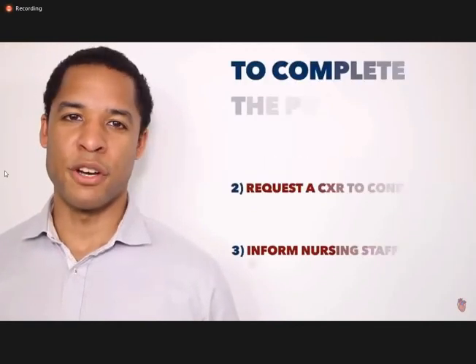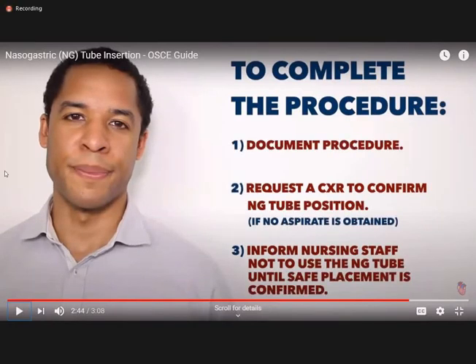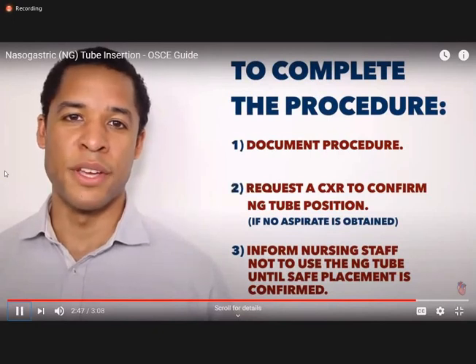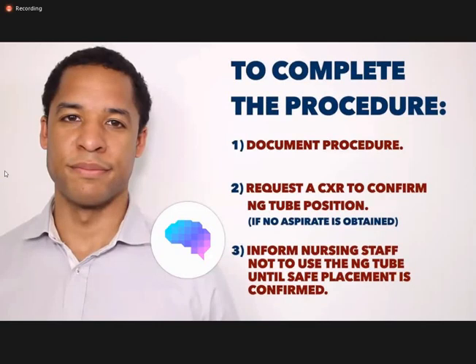I've now finished the procedure. The tube will get a bit more comfortable over the next few hours. To complete the procedure, inform the patient that the procedure is over, document the procedure and the confirmation of the NG tube position. Inform the nurse to stop and not to use the NG tube until safe placement is confirmed. I would order a chest x-ray to confirm the position of the tube if I was unable to aspirate gastric contents.